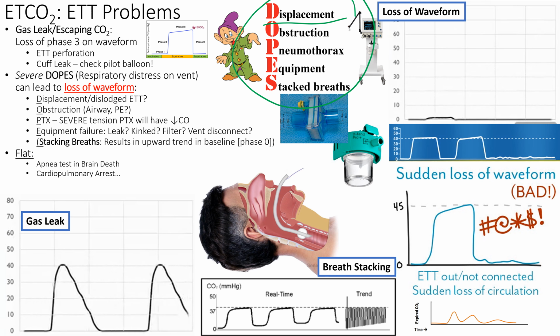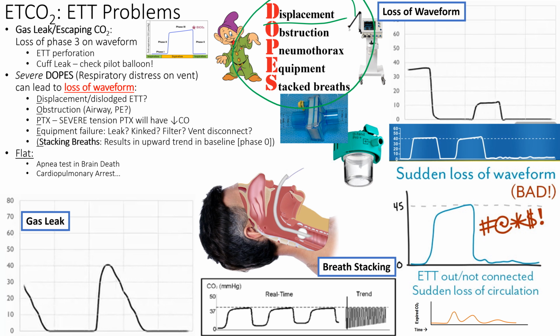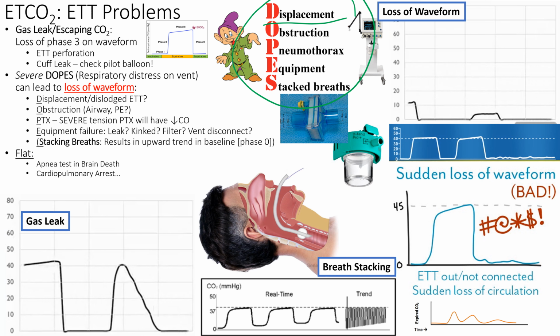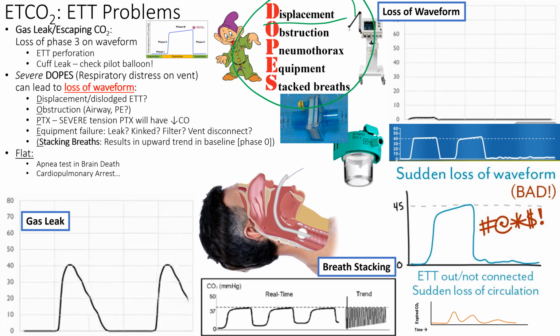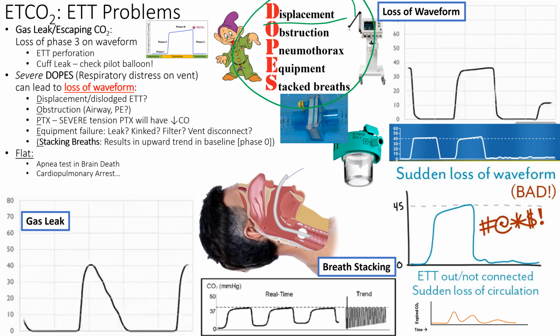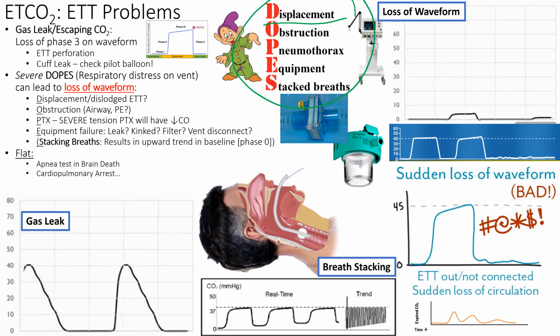So you look at the machine, at the monitor. Oh, yeah, I got tidal volume. Exhaled is different than my inhaled. And look, it says percent leak, 83%. And then you look at the patient, the ET tube is like halfway out, right? So looking and seeing there's a tube displaced. And those other things we can look at as well. Look to see if the volumes are appropriate. The machine will tell you that as well.